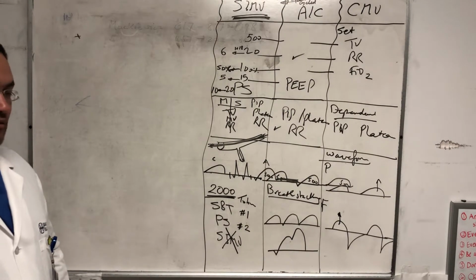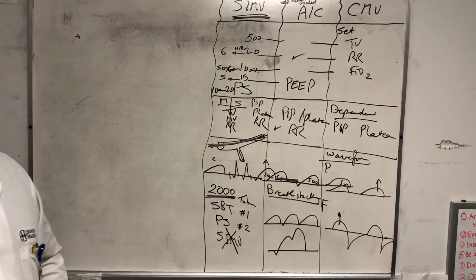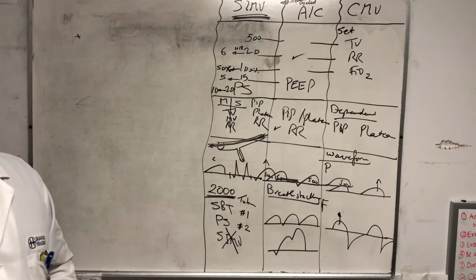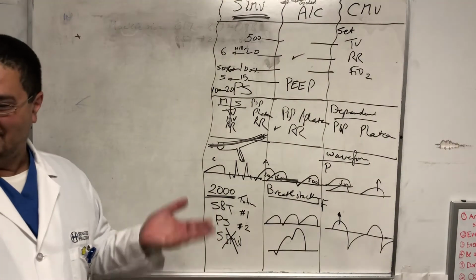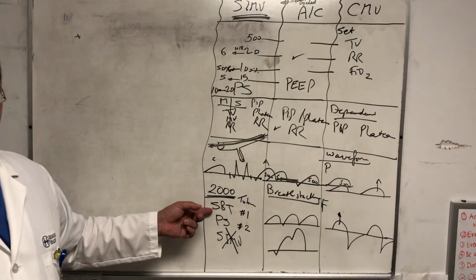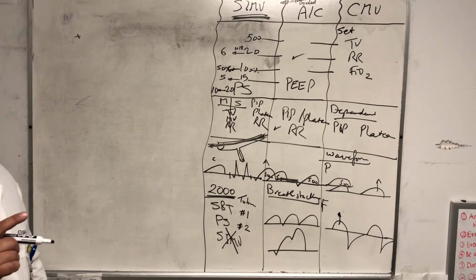But in defense of the surgical ICU people, some of them, very few actually, use SIMV in their ICUs, and they're not using it this way. They're just using it because they're used to it, so they put the patient on it, but then every day they would do an SBT and extubate the patient. So it's kind of not that bad, right?